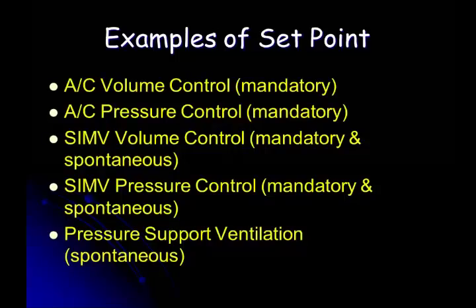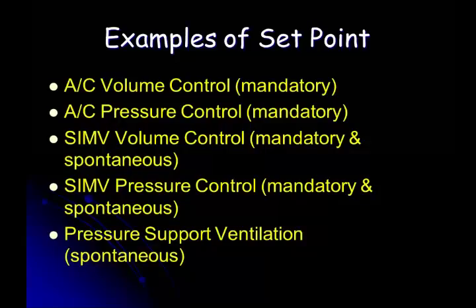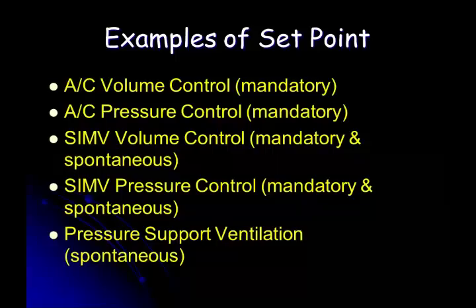Synchronized, intermittent, mandatory ventilation. Synchronized, meaning it's synchronized with the patient. Intermittent, meaning it's not continuous. Mandatory, in the sense that it's intermittently mandatory. It almost seems like an oxymoron. I know. Synchronized and mandatory ventilation. Right.